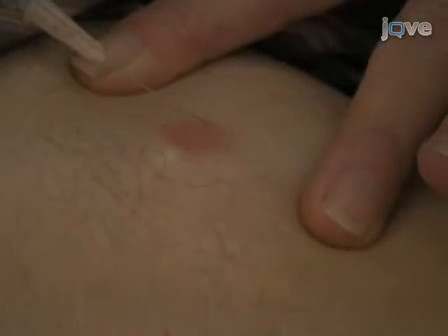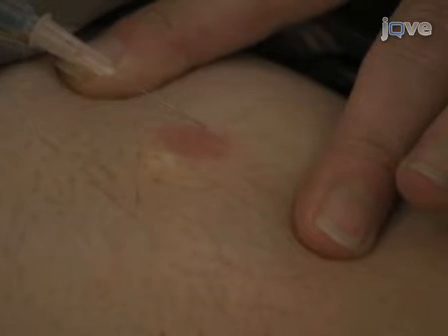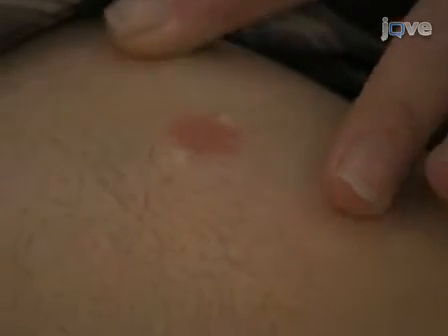Using a 1 cc syringe with 30 gauge needle, inject 1% lidocaine intracutaneously, evidenced by blanching of the skin on injection. Inject just enough lidocaine at these sites to create a very small bleb, with a maximum size of 2 millimeters. Injecting a small amount of lidocaine at the entry and exit points of the microdialysis catheter makes catheter insertion less painful for subjects, but should not affect bioassay results.